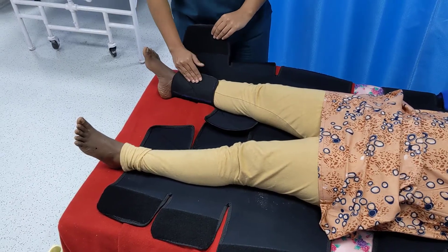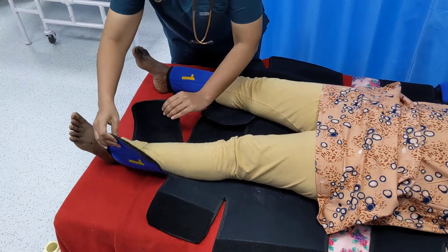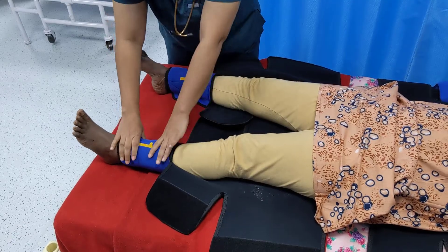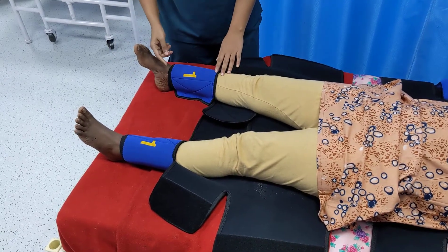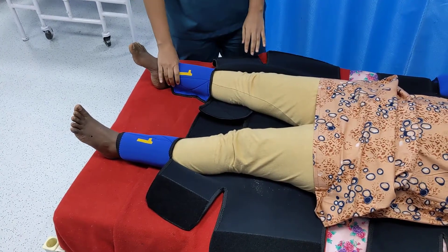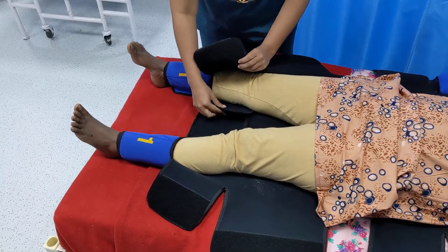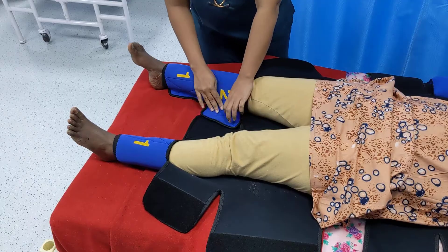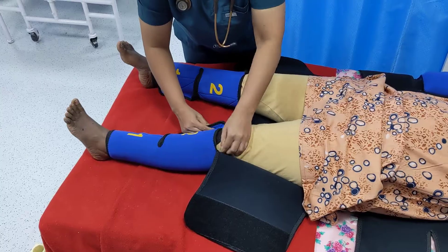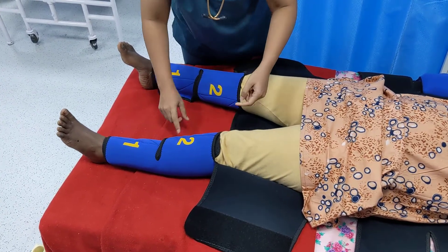First, apply segment number 1 on the lower leg on both sides. To check whether it has been tightened adequately, put an index finger under the segment and pull it out — when there is a snapping sound, it indicates it is tightened adequately. Next, apply the second segment on both legs, and with each segment, perform the snap test to confirm adequate tightening.